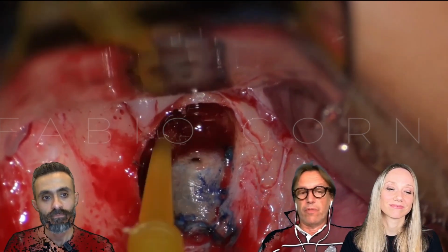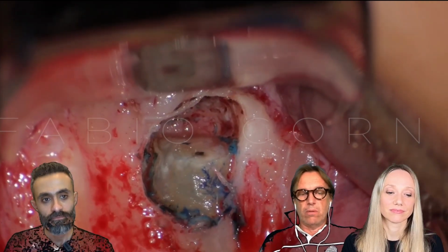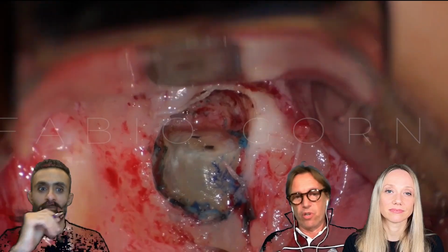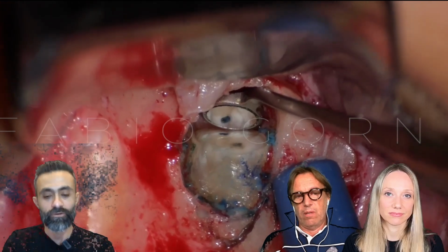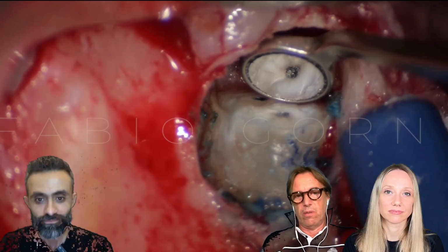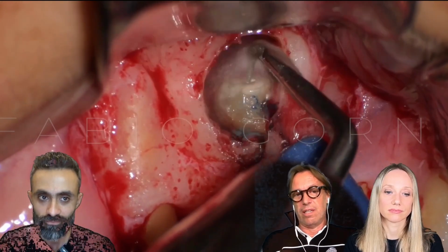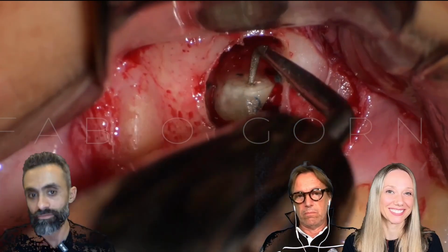Now I'm using a little bit of ferric sulfate just to increase the bleeding control, and now everything is clear, because now is the real part of the surgery that can change our success rates completely. Because endodontic surgery is an endodontic treatment through an osteotomy. So here is the focus of the surgery. This is not a surgery, it is an endodontic treatment. Yeah, I agree.